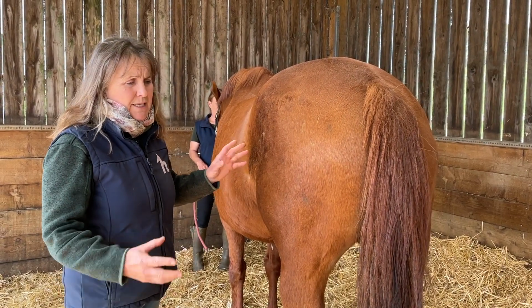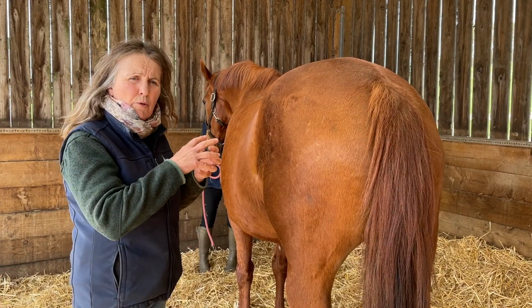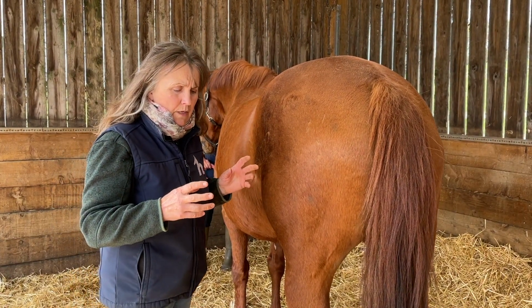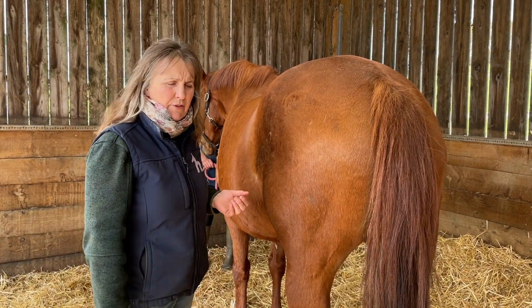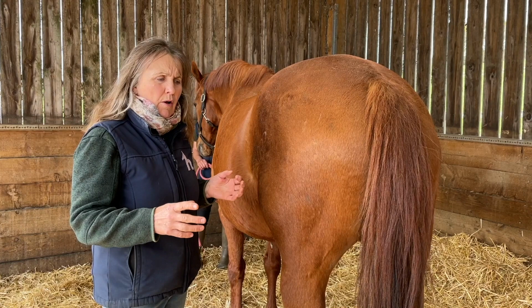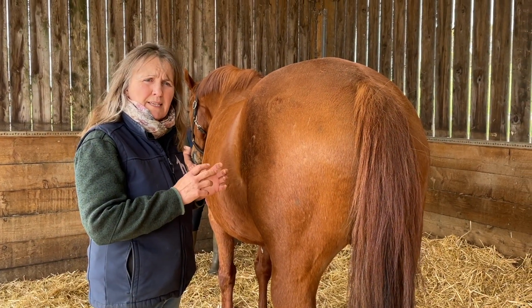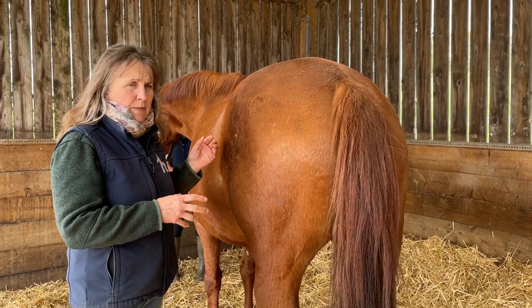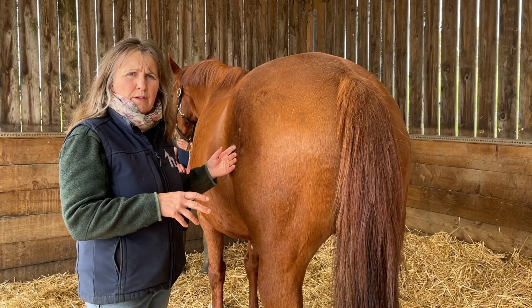It's basically, if you have a little bit of difficulty inserting the thermometer, it may be that there are droppings just in the entrance, and you may need to wait 10 minutes and then go back again and everything will be fine. Obviously, practice this before your horse becomes ill. This should be second nature to you, and anybody who cares for horses should be very familiar with the procedure.